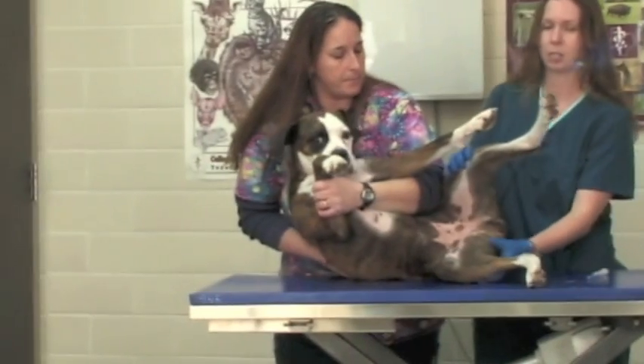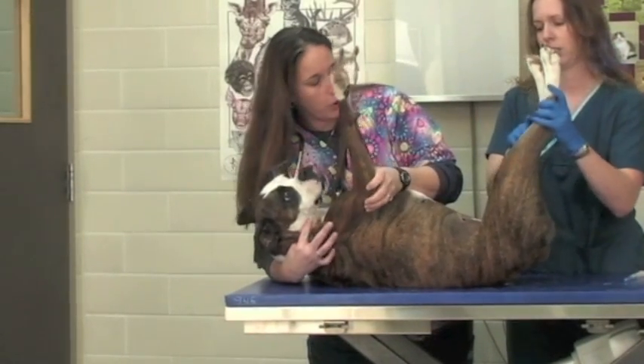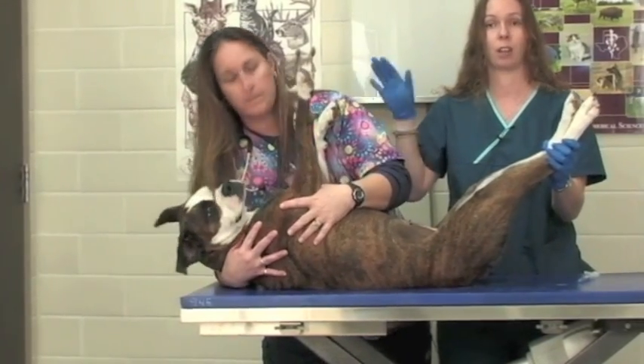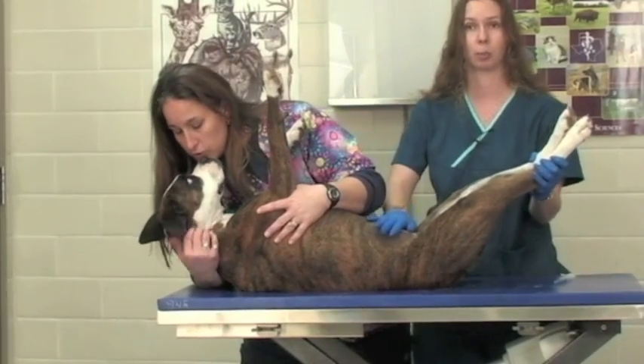For dogs, the easiest way to obtain a cystocentesis is for them to lie on their back. You have to make sure that your restrainer has a very good hold on your patient. You don't want them to wiggle if you're going to place a needle into your patient's abdomen.